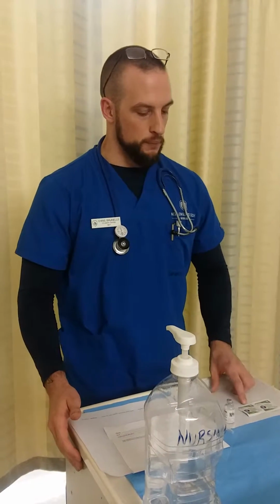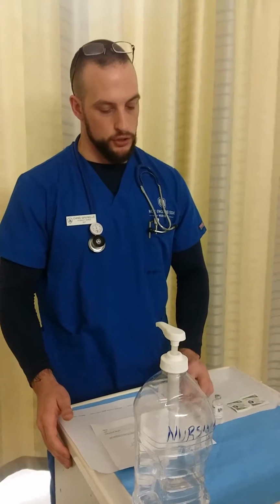Hi, I'm Chris, and today I'll be administering medication via IV. So the first thing I need to do is gather my equipment, which I already have. I have my medication cart, my alcohol prep pads, my 3 milliliter syringe, and my medication.